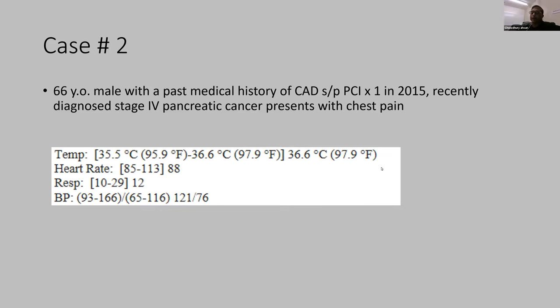But that is a small point, because sometimes you can hold their hand and say, you will be fine. Keep atropine at bedside and also pacer pad, and you can fly through the surgery. But the main reason was that the HV, we proved that it was longer. Normal HV is 35 to 55. So next case.